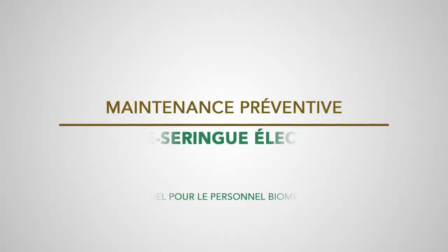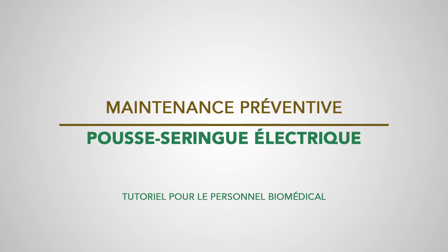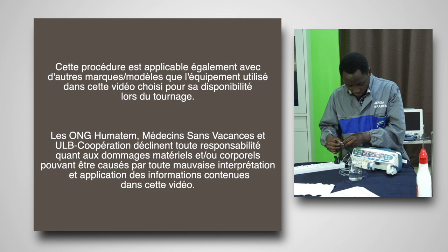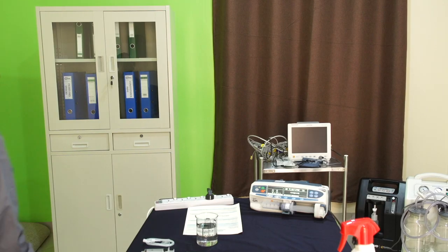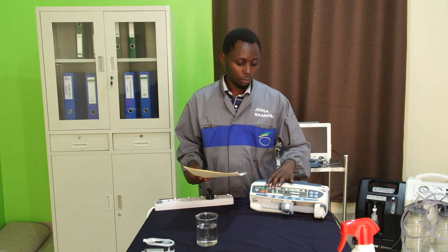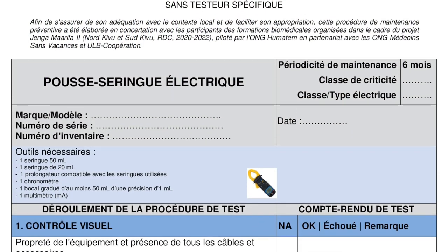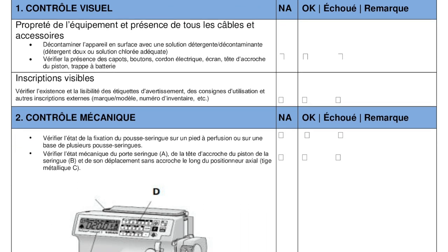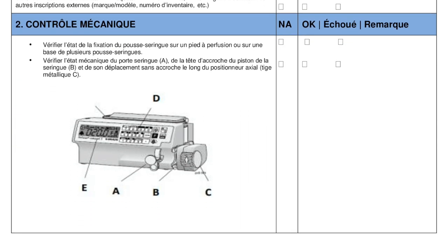Bonjour les amis, nous allons vous présenter une procédure de maintenance préventive pour un pousse-seringue électrique. La procédure ne nécessite pas l'utilisation d'un testeur spécifique et s'adapte à tout type de pousse-seringue électrique. Vous pouvez télécharger la procédure complète via le lien sous la vidéo.